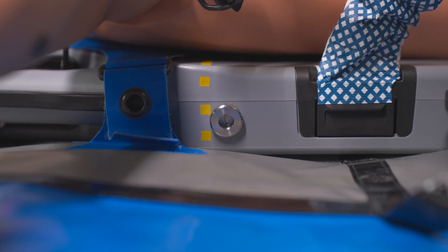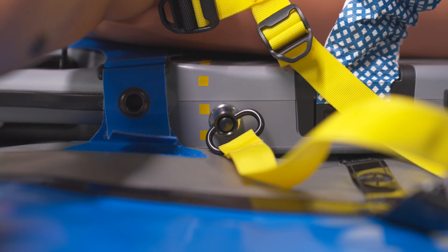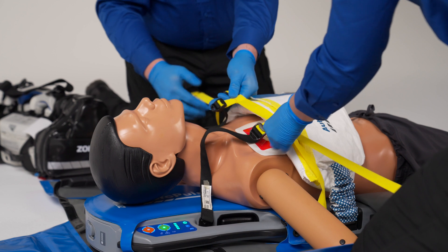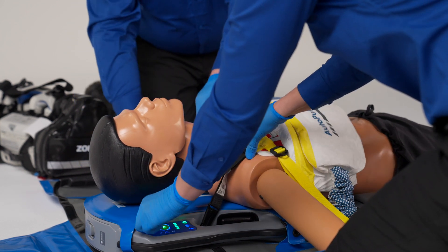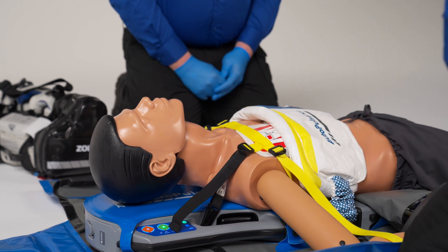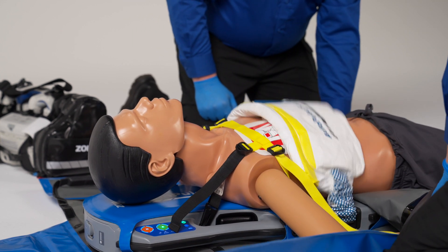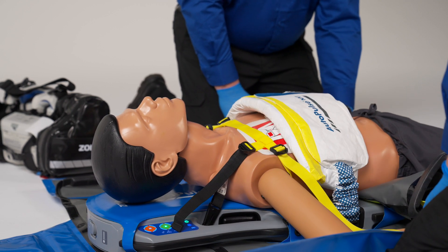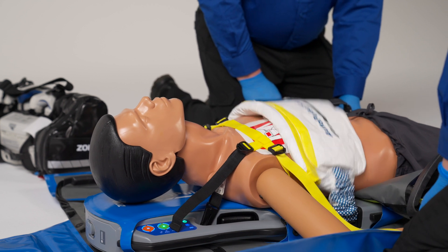Now secure the patient to the platform using the shoulder restraint. Secure the yellow straps to the quick-release sockets located at the yellow line at the patient's armpits. After clipping the shoulder restraint to the platform, adjust the yellow straps first, then the black straps. The straps should be tight enough to secure the patient, but not so tight as to impede full chest recoil. Be sure to position the center strap between the AutoPulse NXT band and the patient's sternal notch.